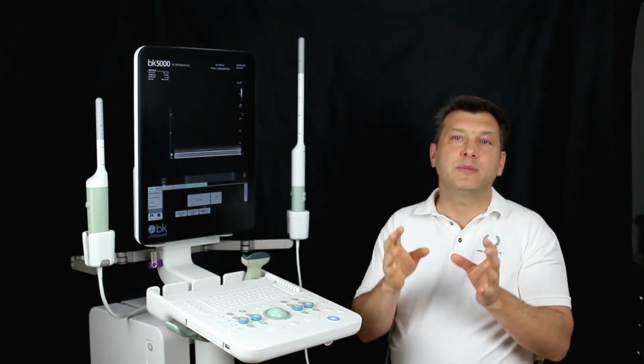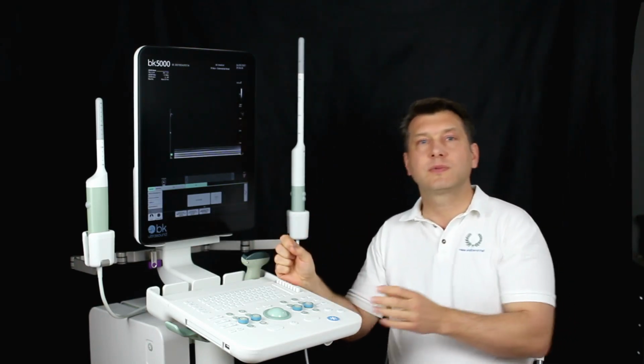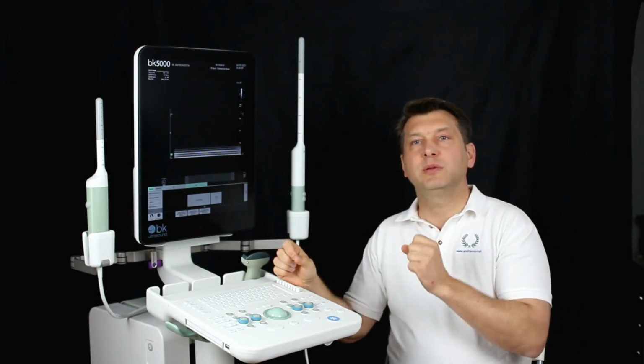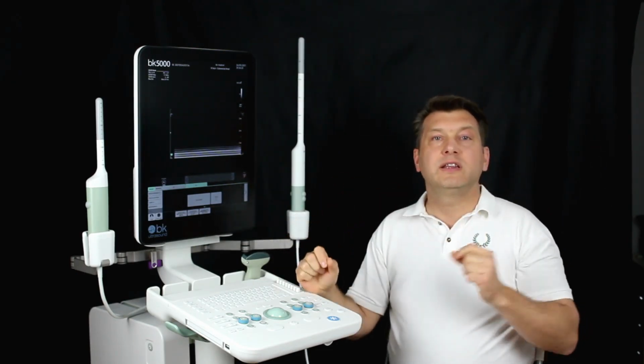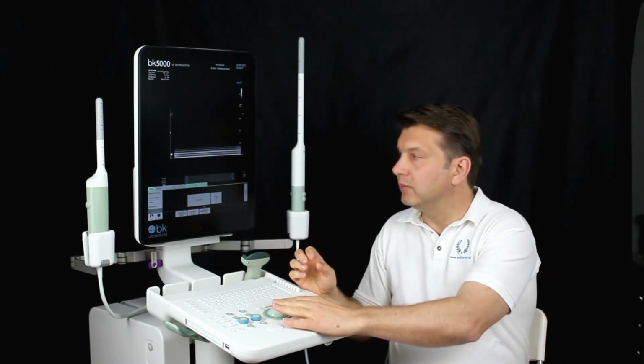But the more frames in the box, the longer it takes the device to obtain these pictures. When assessing the anal canal, if no disturbing factors, for example pain, are present, this distance should be chosen as small as possible, 0.2 millimeters.